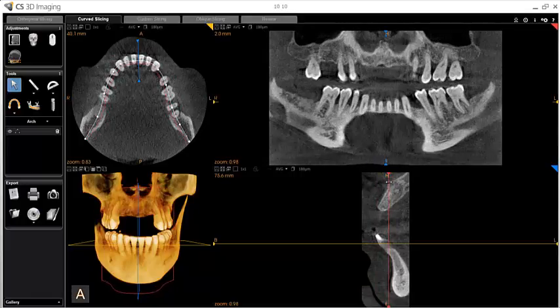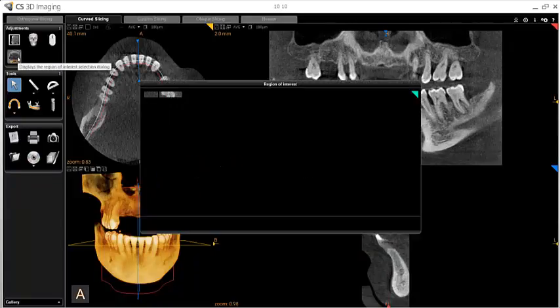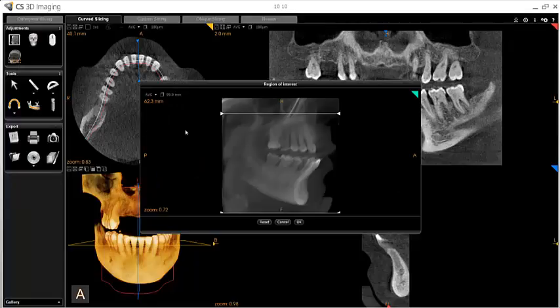To adjust the field of view, click the Region of Interest tool, then use the white horizontal lines to display more or less of the image.